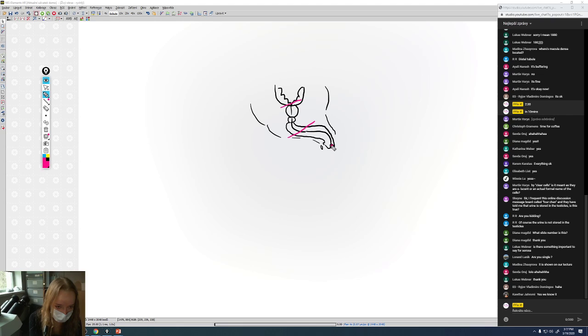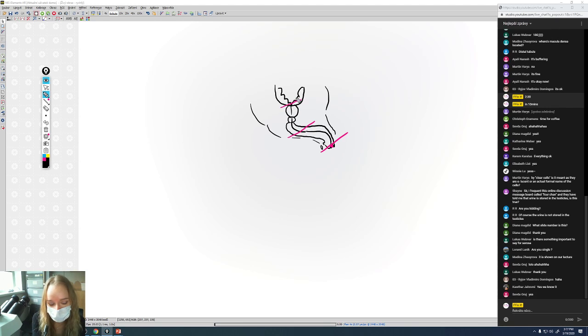Some slides are through the body of the penis and some are through the glans. So there is going to be different epithelium in the urethra. You know, the urinary bladder contains transitional epithelium, but the urethra in the penis right here in the body of the penis is lined by stratified columnar epithelium.